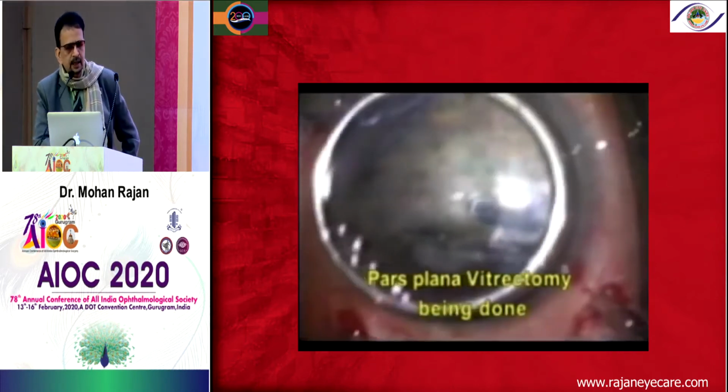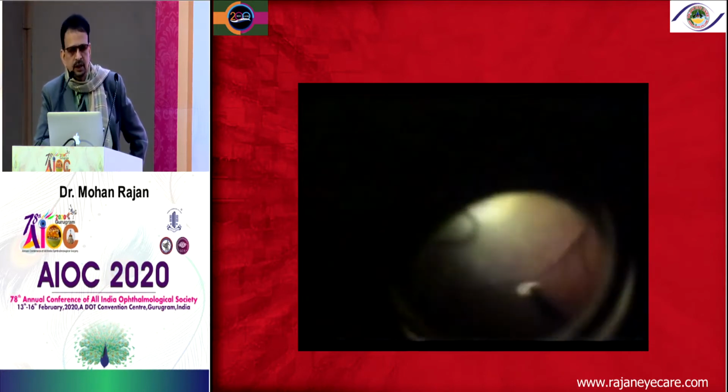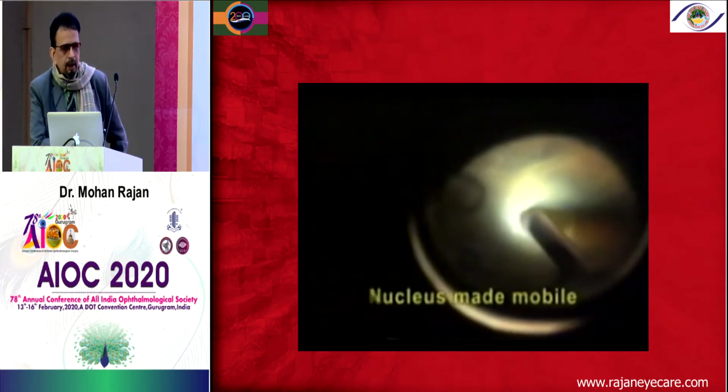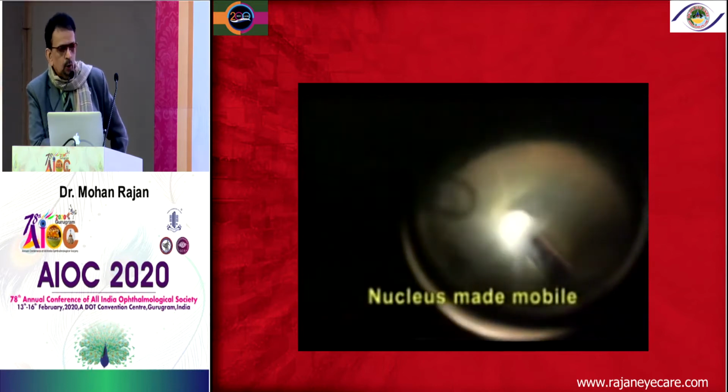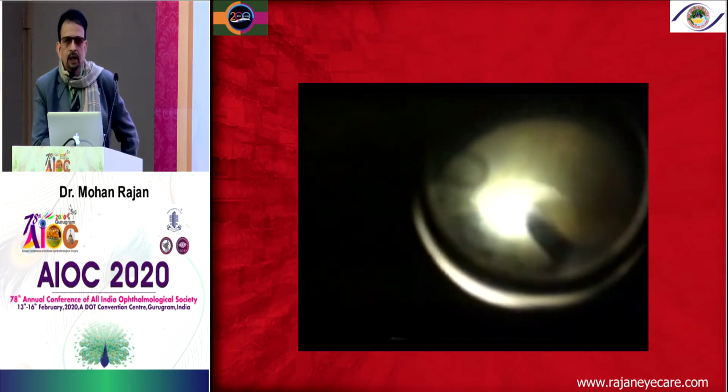But in this case, with a posterior polar cataract, usually the nucleus is very soft. You can see here, I went in and used the sleeveless phaco probe itself like a fragmatome, and then bring it up. And this can be done only by the vitreoretinal surgeon.